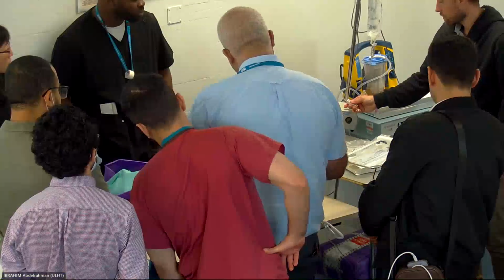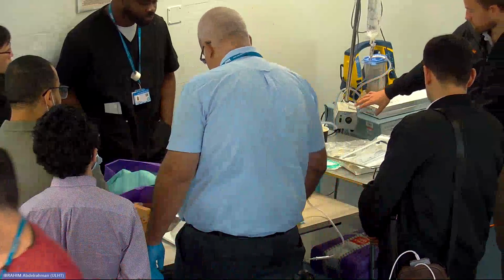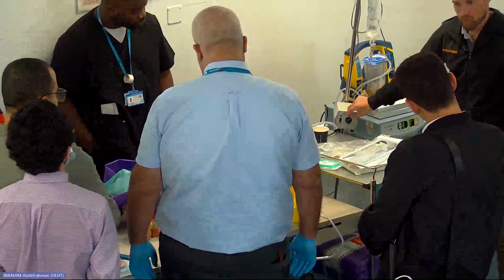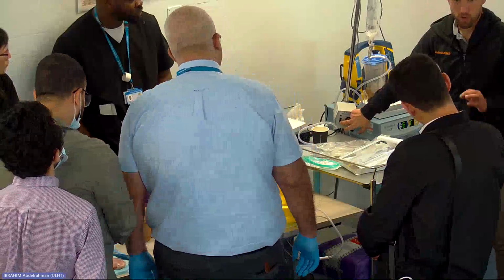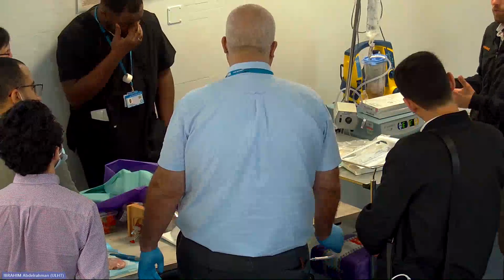Put the switch down. So just to reaffirm, two things in here. The saline is flowing everywhere. Make sure the tubing is sitting on the silver plate correctly, and that the switch is down to auto. The light is off to start with. When you feel the pedal, the light comes on, and the valve opens.